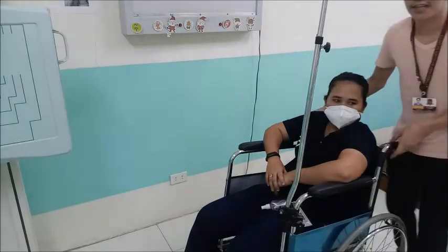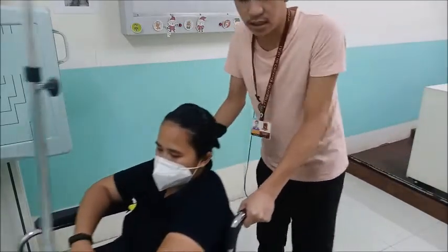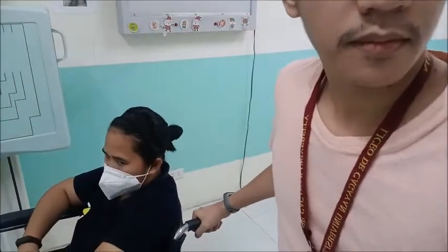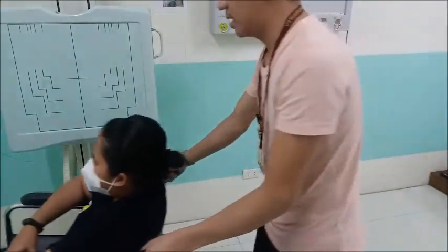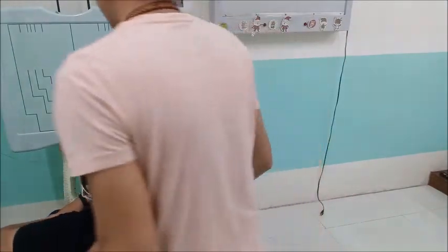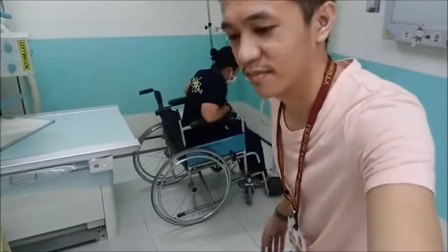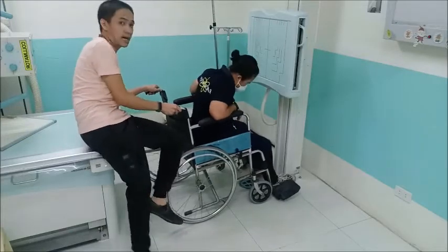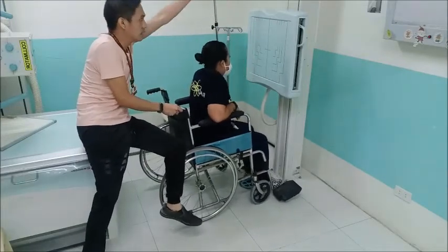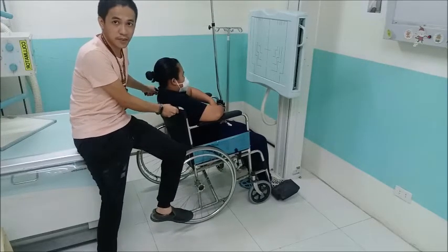Okay? So, if yung patient is naka-wheelchair tapos mag-chest PA ka, you can direct the wheelchair. You can bring the wheelchair closer towards the chest stand. Okay. So make sure na mo na center daan. The center of the chest bucky is also at the center of the patient, ang vertebrae niya, if ever ipatindog na to siya.